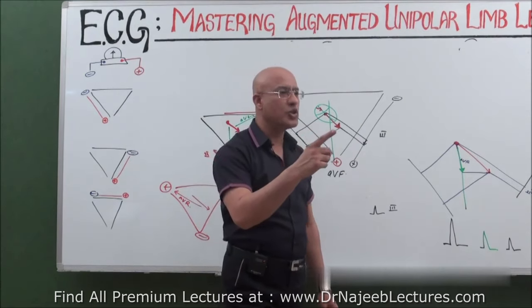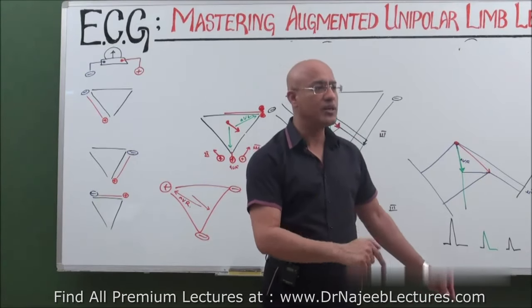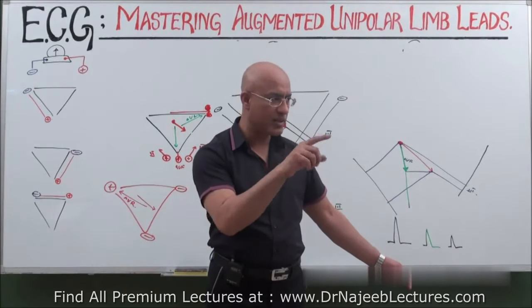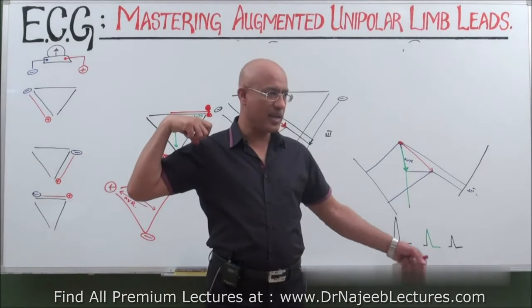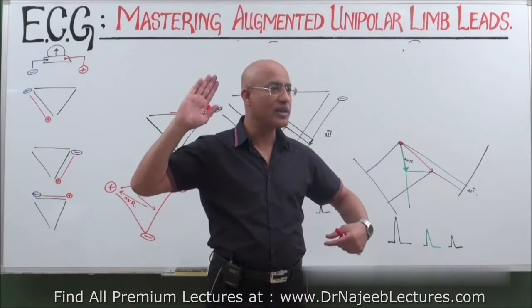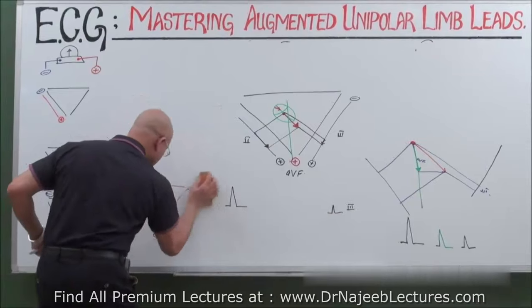You remember the theory of the ECG? When the girl is moving towards the boy, the deflection is up. So for all the leads which are down or left, usually their deflections are positive. The major QRS deflection is positive. And this lead, what is this lead? AVR. Right? Here the major electrical activity of the heart is moving down and left. So it is seeing positive charge going away. The girl is going away. The deflection is negative. Right? So now I will show you something interesting before we go into further detail.